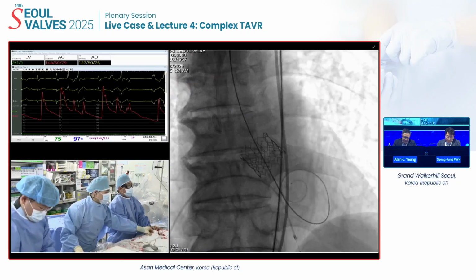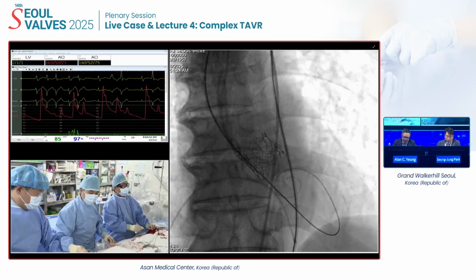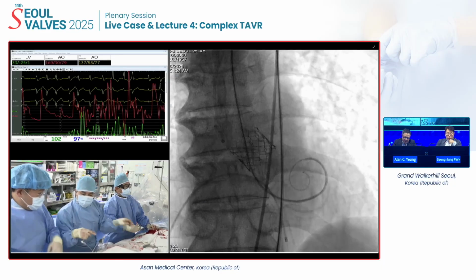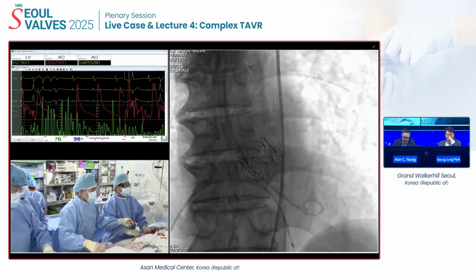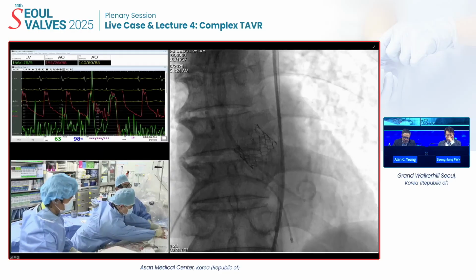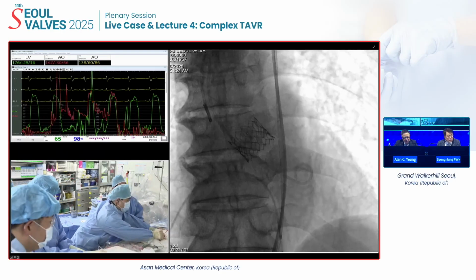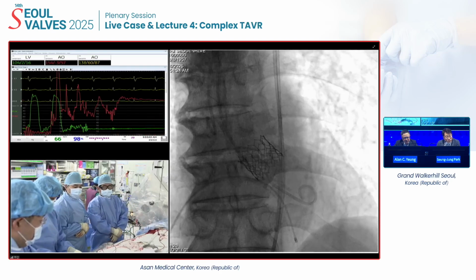But if it's mild and doesn't cause renal dysfunction, it'd be supportive, meaning that if they lose blood, you might give them some blood later on. If it is big enough to plug, you might want to do a paravalvular leak plugging later on. How about the aortic position? Yeah, they're relatively rare, because the pressure difference is not as much.